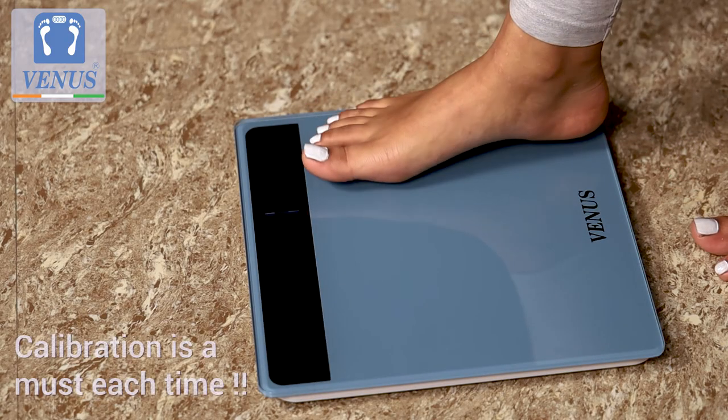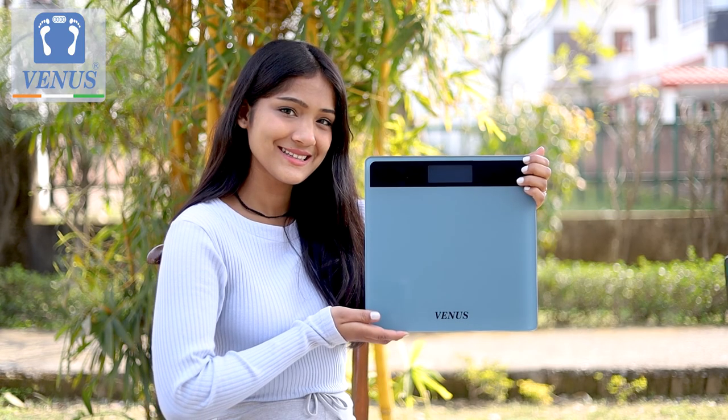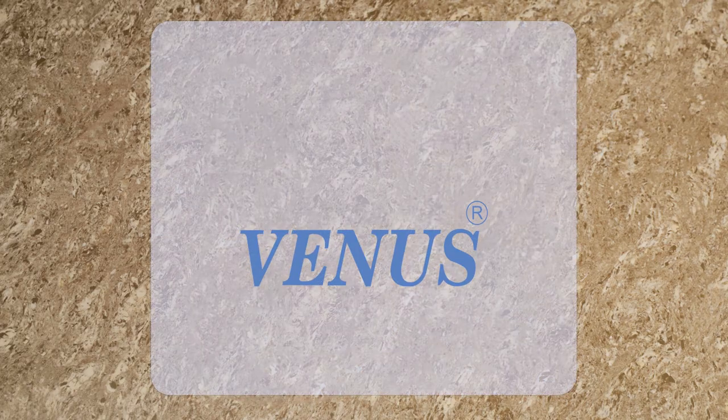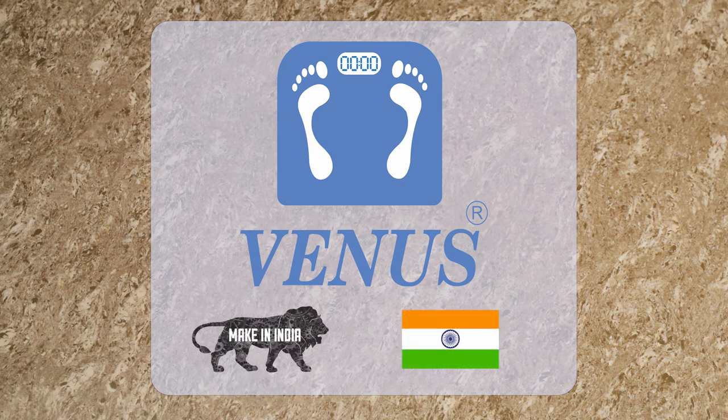Do remember that calibrating the machine each time guarantees accurate reading at all times. So what are you waiting for? Get your Venus Body Weighing Machine today. Venus — your partner for a healthy living, a made in India product.